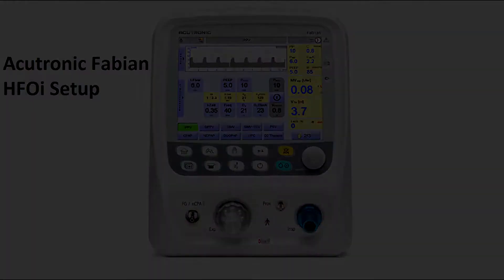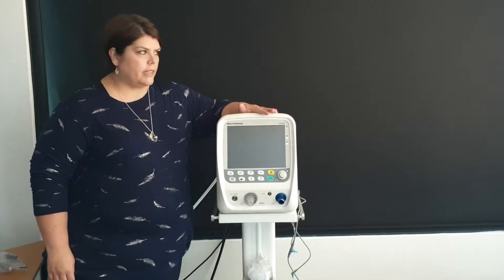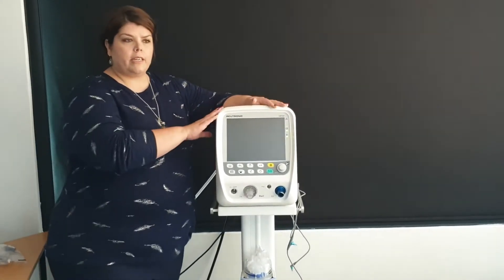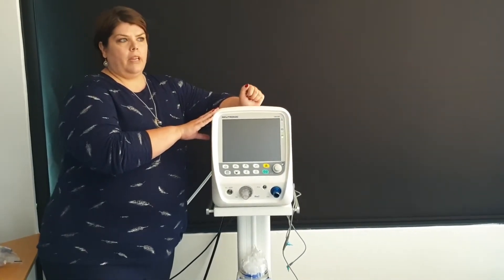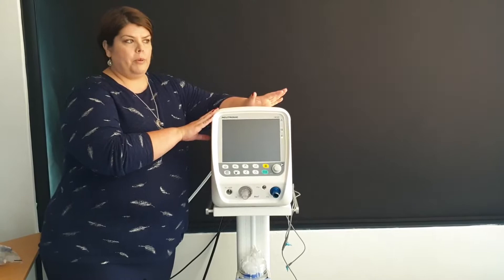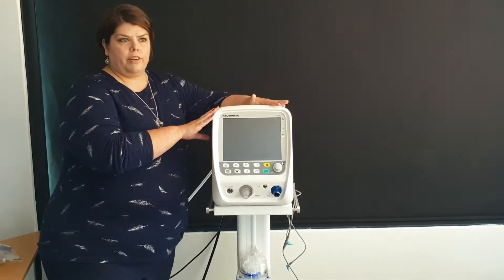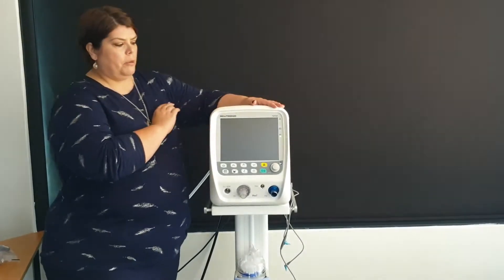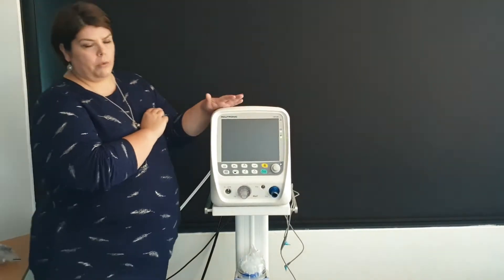Welcome to the introduction to your HFOI Acuatronic Fabian ventilator. Today we are going to do a circuit setup so that you understand how your circuit works. In a separate video clip we will show you how to connect your non-invasive mask, and in a third video clip we will show you the orientation of your machine and how it basically works.